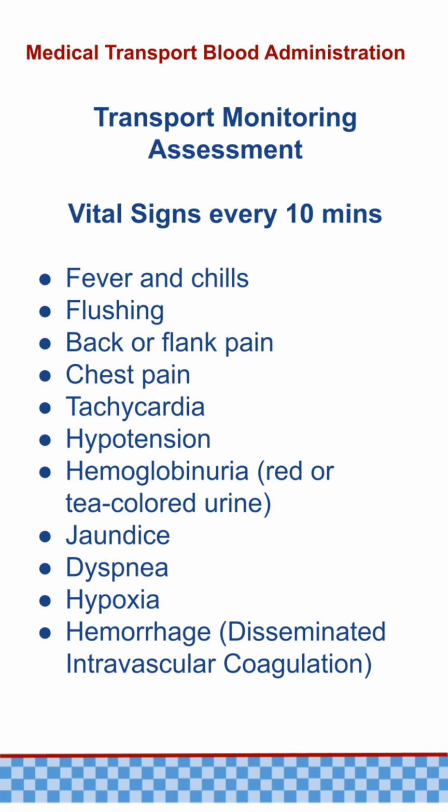During the transport of patients with active blood administration, you must check and document a complete set of vital signs every 10 minutes. Continuously observe the patient for signs of hemolytic reaction.